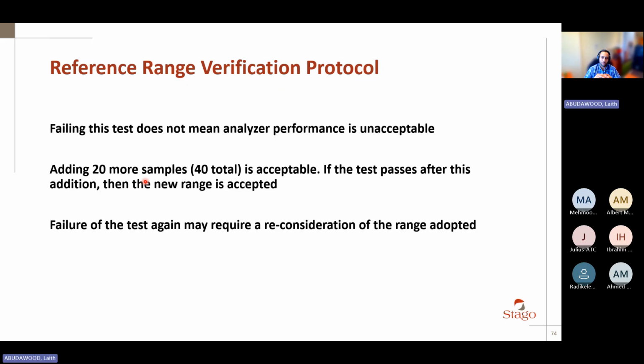For most countries in the Middle East, 15.3 seconds is a very short or very low reference range to use for the population. A lot of the labs that calculated their own reference ranges for Neoplastine reached 16.1, 16.2 seconds. So this means a lot of normal people who can read 15.4, 15.5, 15.6, 16 seconds will look abnormal if you use the Stago range.